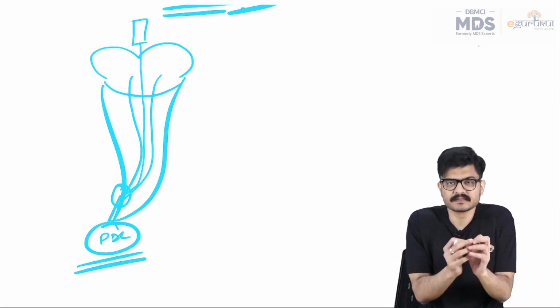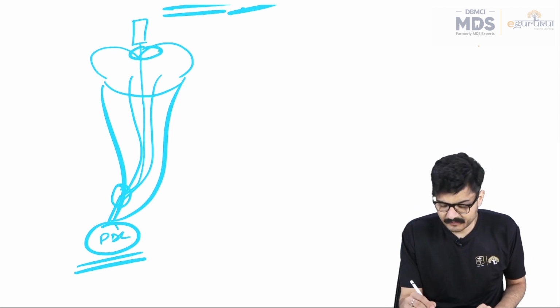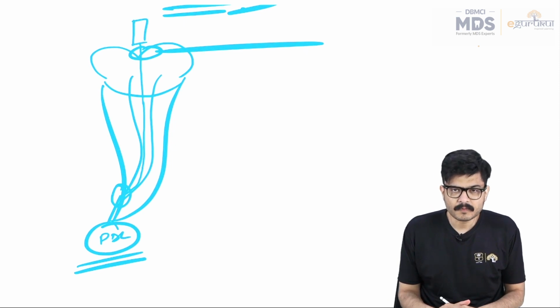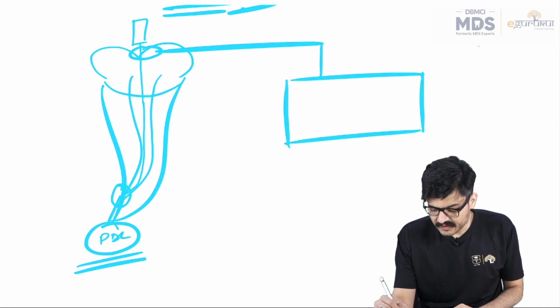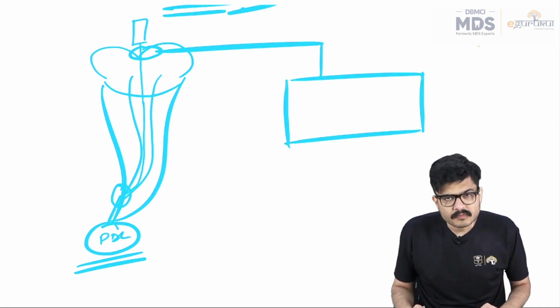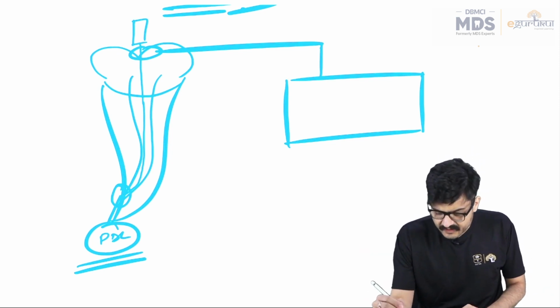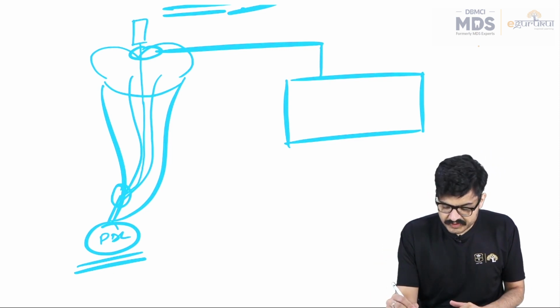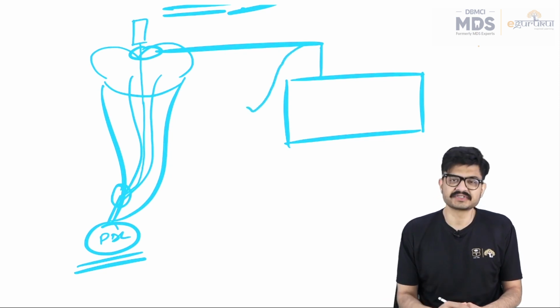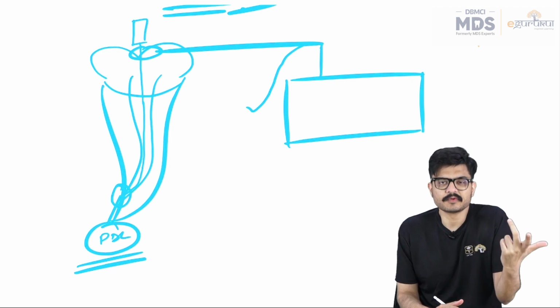So I connect a metallic electrode to this file, right friends? And there is this electricity generator panel, which is battery operated or electricity operated, whatever. And there is another electrode coming from this, which is in contact with the patient. Either the patient is holding it in his hand, or there is a metal electrode in contact with the labial mucosa.